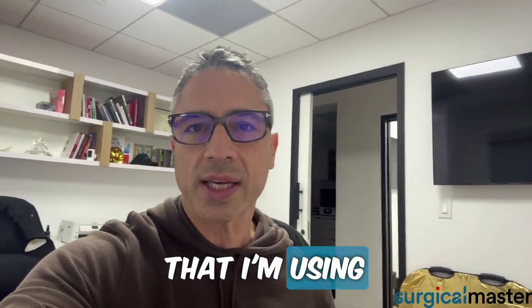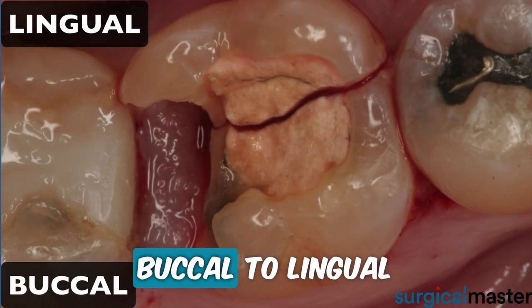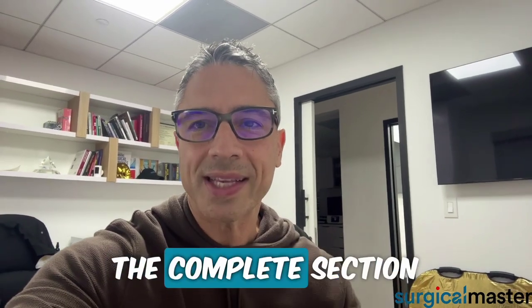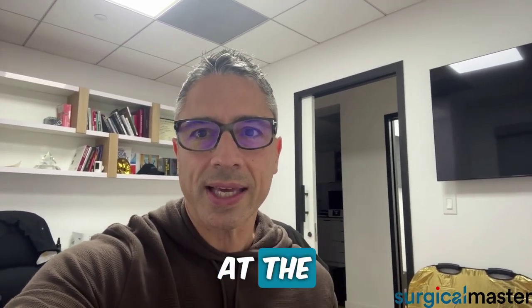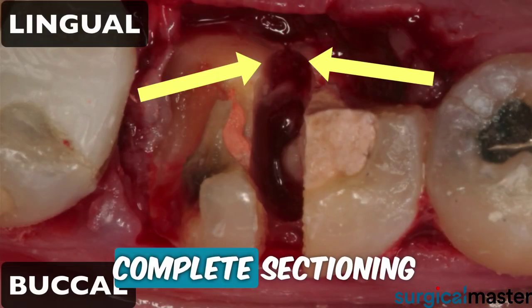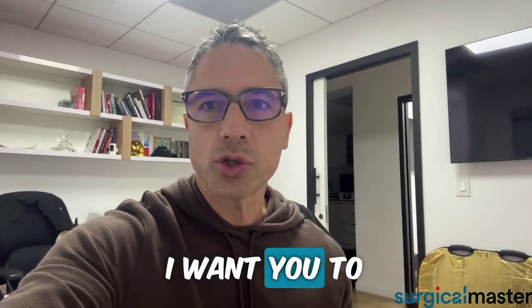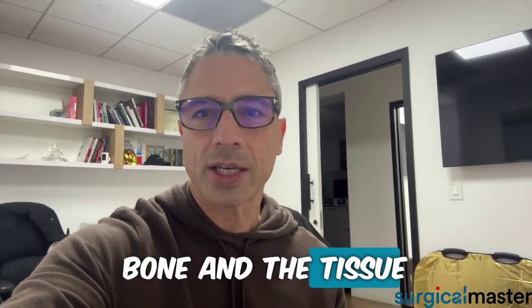The burr that I'm using is a 701 long, and I section from buccal to lingual at the furcation level, progressing towards the lingual. But before you finish the complete section, stop, take a mirror, and look at the view of the occlusal surface. See how far you have until complete sectioning of the roots, then go back and complete the sectioning. I want you to stop right before you finish so you don't section the lingual bone and tissue.